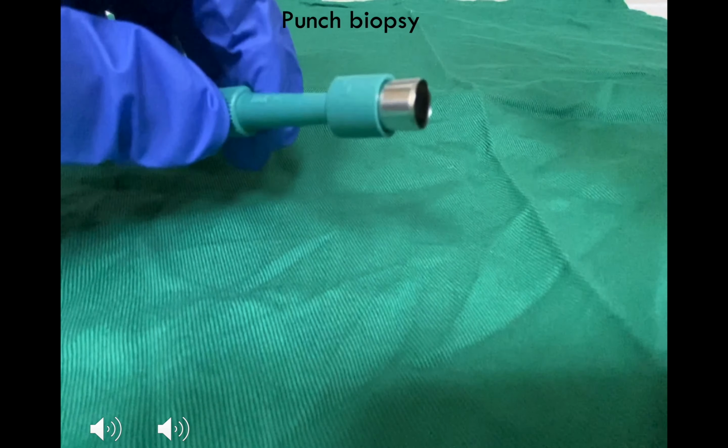And I use a tissue forceps to gently hold the specimen. Then I use a scalpel blade to carefully incise the base of the lesion. Alternatively, you can also use a tissue scissor to remove it from the base. Okay, so now we have the lesion, and the specimen should be placed into the formalin as soon as possible.